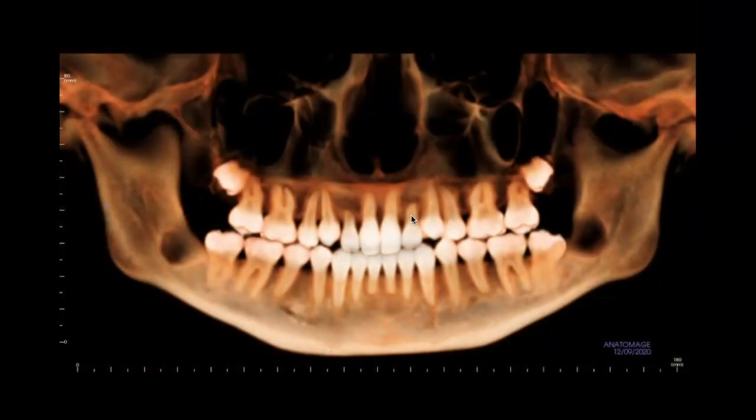She kept the roots, which were great. The 12-year molars on the lower did come in. The wisdom teeth were removed on the bottom. I'm trying to remember why we didn't. Oh, yeah, that's right, because the top ones we're going to use because she's a shorter tooth. So she had the lower wisdom teeth removed. Now, did we upright the roots perfectly on the second molars? No. Again, hindsight's 20/20. Go back, put a bracket on that tooth, get that root back a little bit.